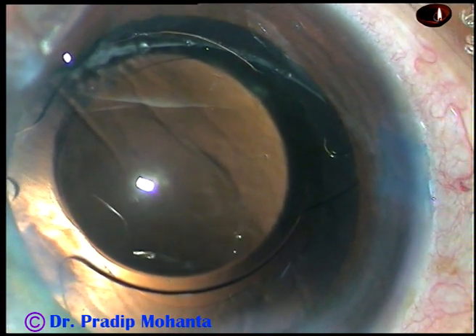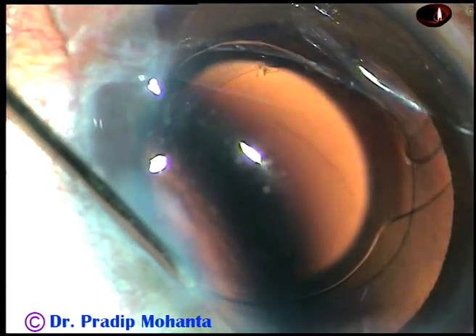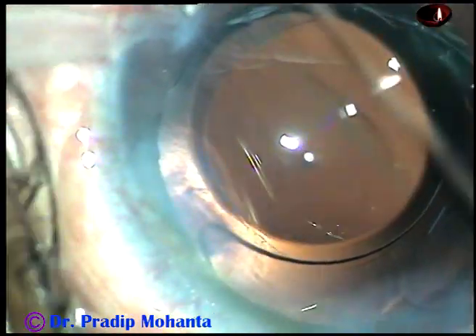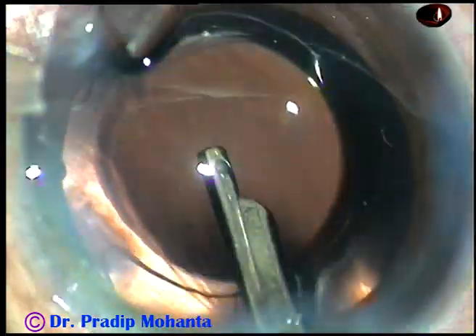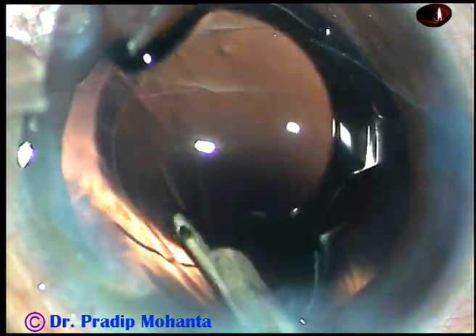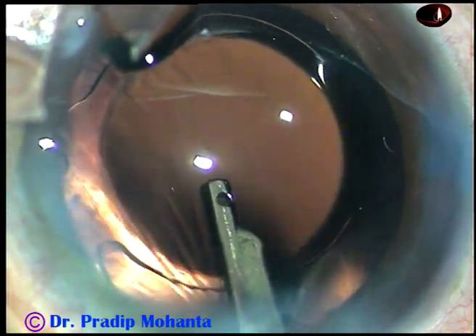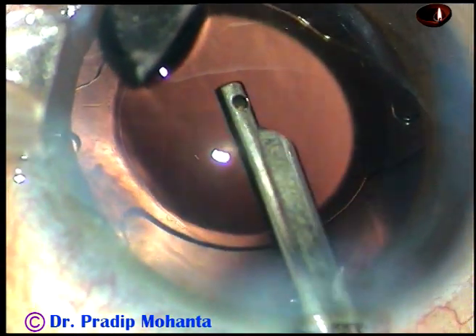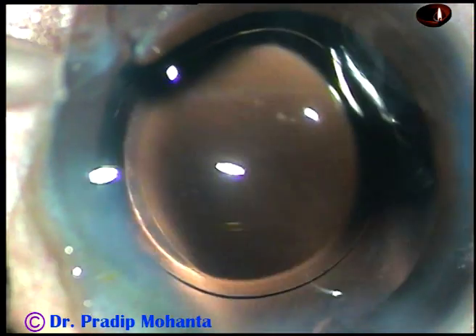This is a bit of moxifloxacin injected at this time. Now I hydrate the side ports and then this is the final lavage. The moxifloxacin that I have injected is mostly washed out — consider that I have not used moxifloxacin intracamerally. If you do a clean surgery, moxifloxacin doesn't have to be implanted intracamerally. After surgery my assistant puts about 4 to 5 drops of moxifloxacin over the ocular surface, and that is good enough. This last lavage is very essential — there should be a clean, clear anterior chamber at the end. This prevents post-operative inflammation. Check the wounds and then conclude the case.